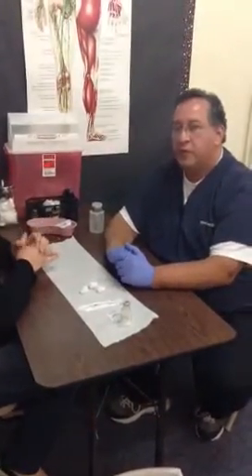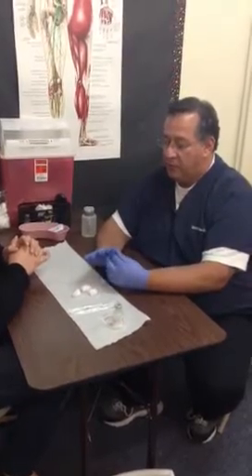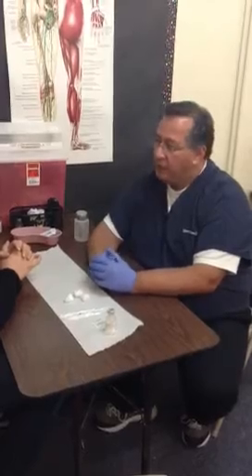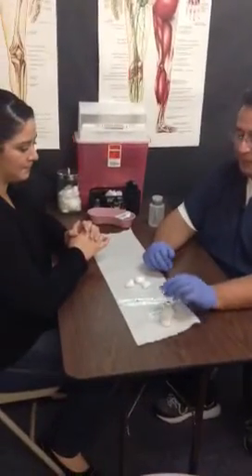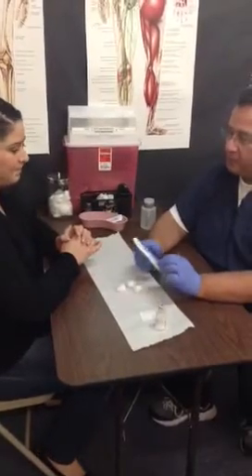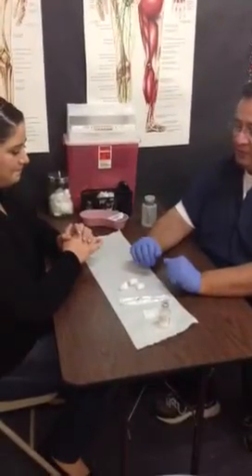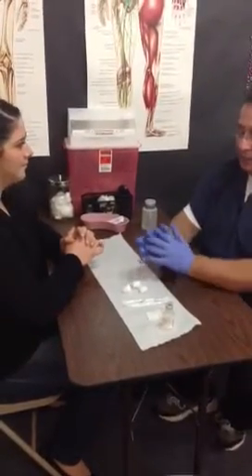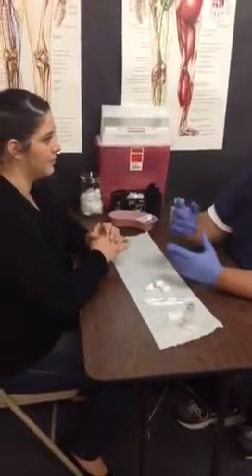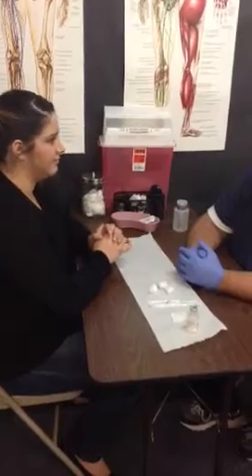Once you know that you have the right patient, you want to determine whether or not your patient is allergic to anything you're going to be using. So Jane, are you allergic to sodium chloride? No. How about adhesive on tape? What about metal we're going to be using for the injection — the needle? And how about cotton? No allergies. This injection is going to be given on the upper part of your arm, either left or right side. Do you have a preference? On my right. Okay, I'll go ahead and get everything set up and I'll be right back.